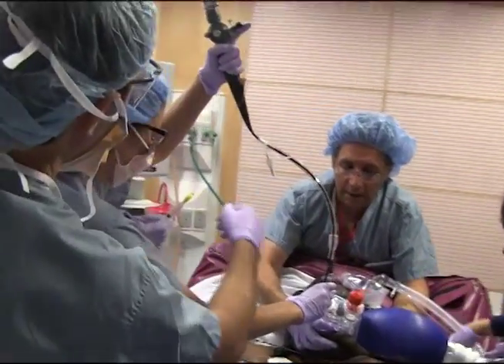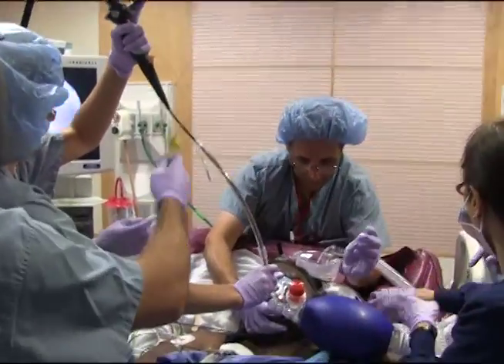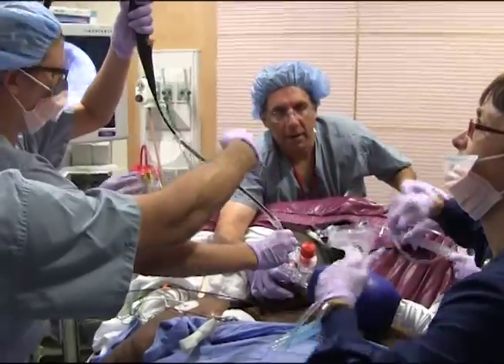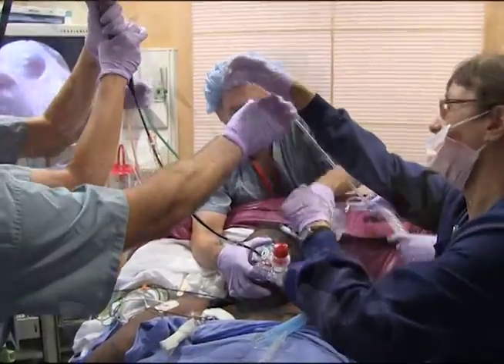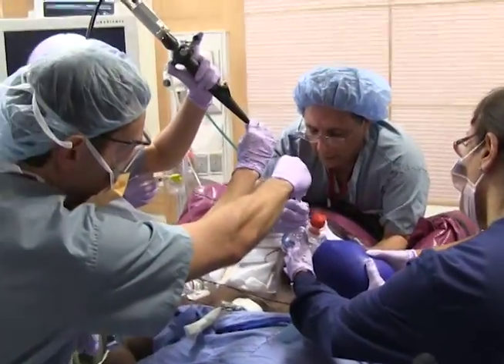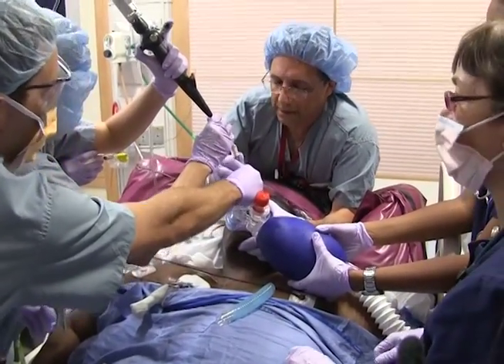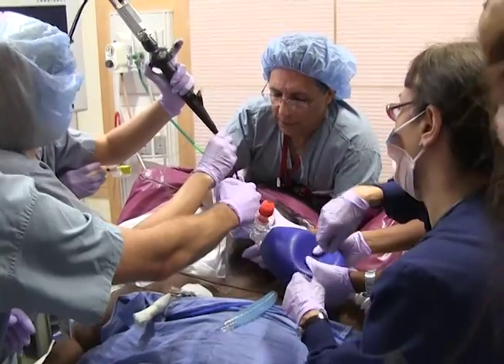endoscopy mask through the oropharyngeal airway, which has been placed in the oral cavity and pharynx, and into the larynx and trachea. The tracheal tube is now advanced through the diaphragm of the endoscopy mask and into the airway.